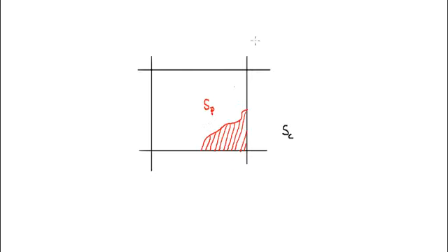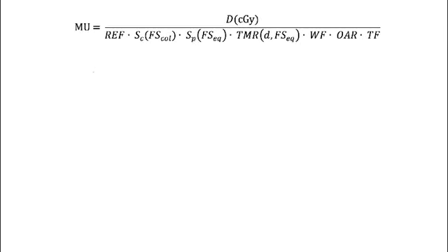And so that's the collimated field, the field with all the collimation in it, the blocking and everything, so this inner field. So those are the two different factors. So SC, the open field with jaws, SP, the blocked field with all the blocking, MLC blocking in it. So let me rewrite this formula up here at the top. This is a very important formula relating dose to MU. So let me write it out very neatly. And then we're going to run through an example of how you might do a calculation for monitor units.